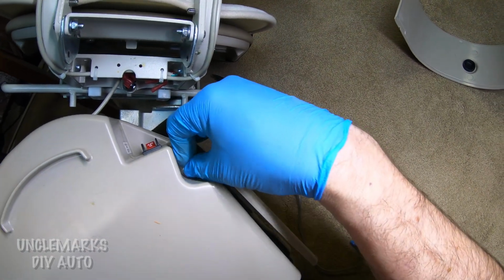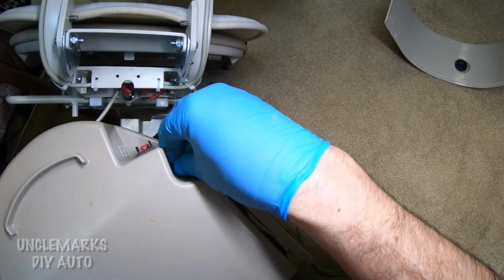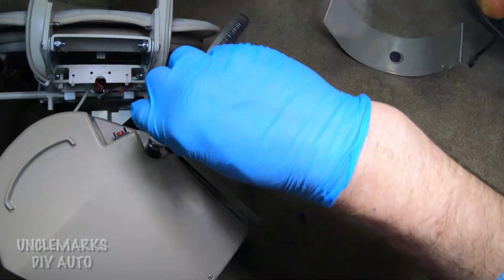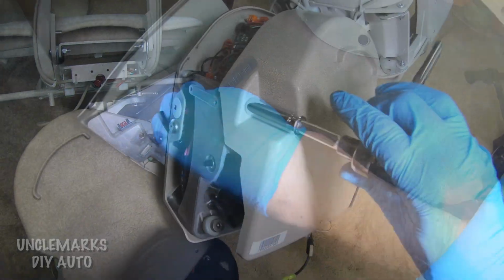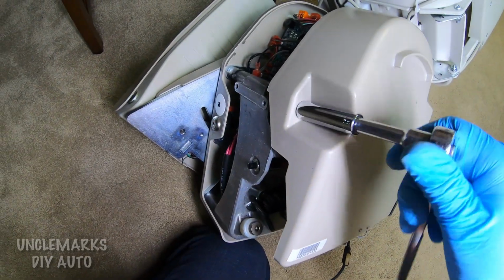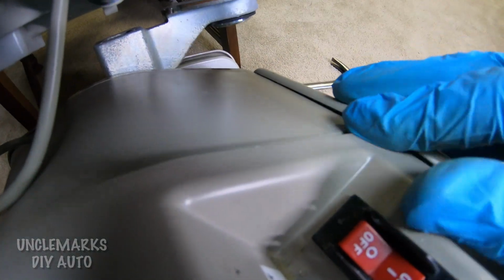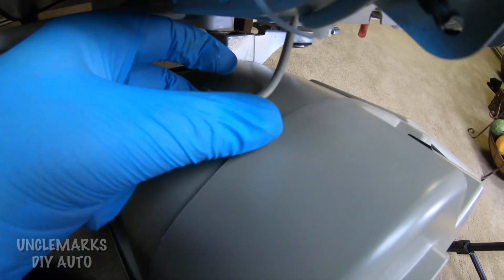Anyway, we'll get this bolt back and you can understand what's going on. Hopefully you've got some help from watching this video. I'll give you a couple ideas of things you can check, you can test on your own. Just make sure you have it unplugged from the wall and turn that power switch off, this red one here, while you're working on it as well.